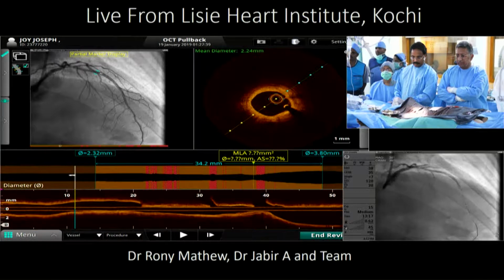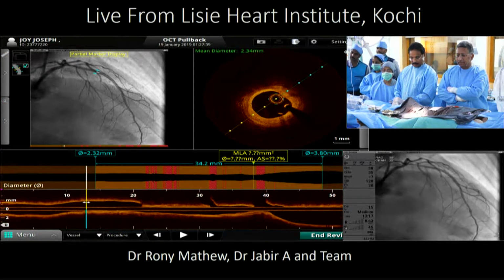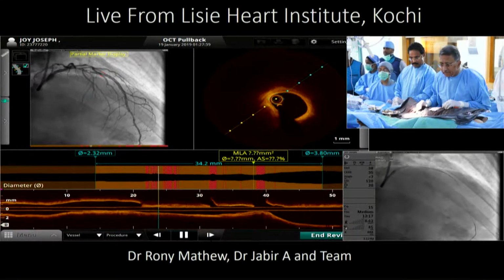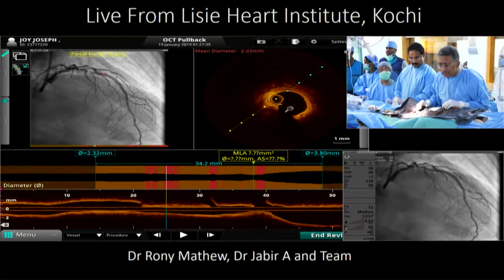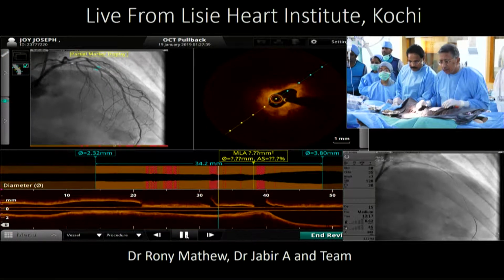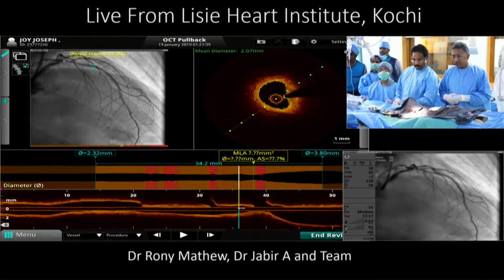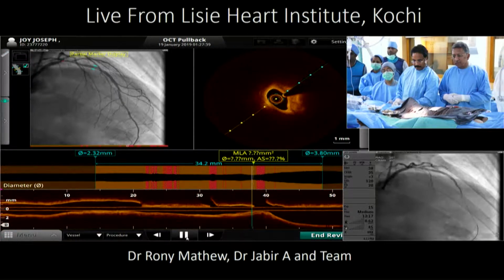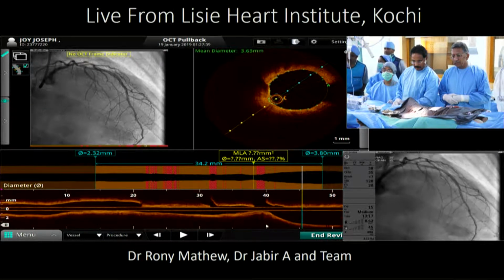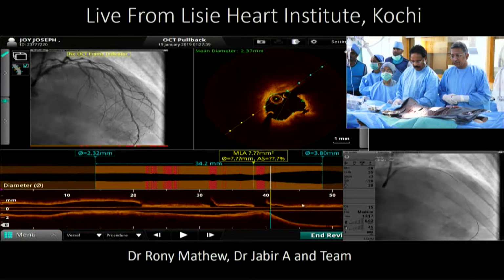So the nice part is that we have a co-registration that will allow us to define and identify the potential landing zones. So first, let's review the LAD, and we see that there is diffuse disease, but here we are in the proximal LAD, and there is obviously a mixed fibrolipidic plaque. You see, it's more severe than expected on angio. The lumen is 3.45, and we go now. Oh, it's very tight here, just after the left main, and as we could suspect on the angio, the distal left main is not free of disease. You see that this is definitely the distal left main, and the lumen is 4.5.